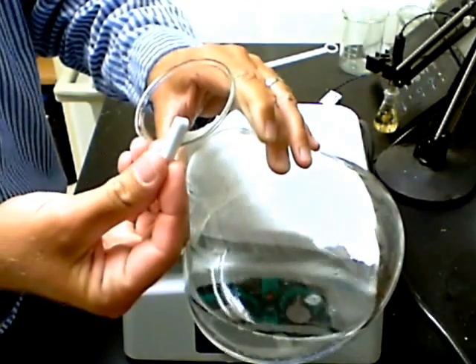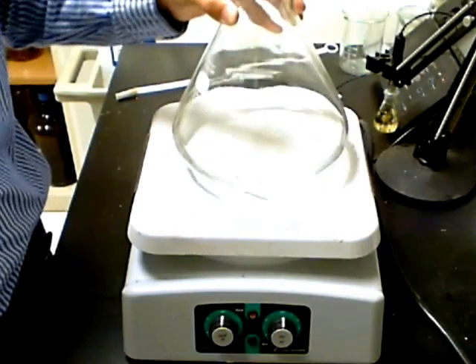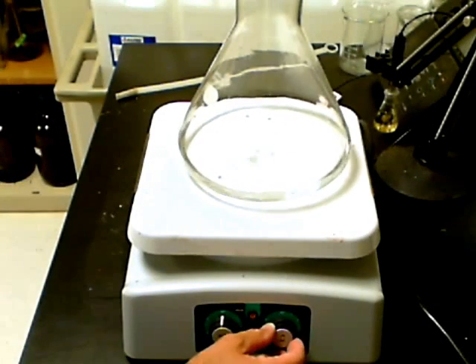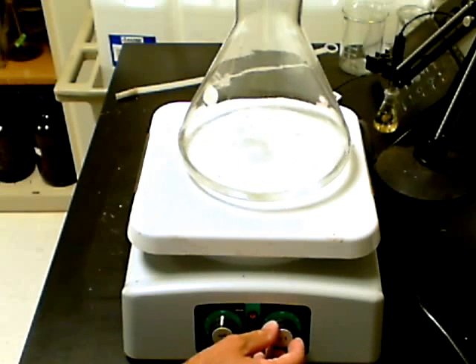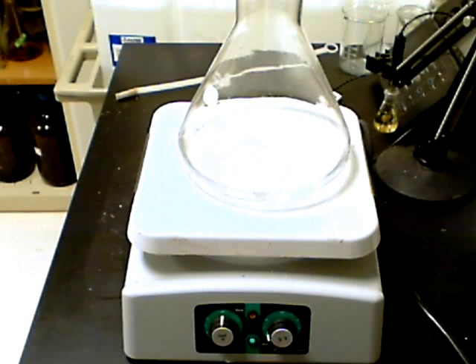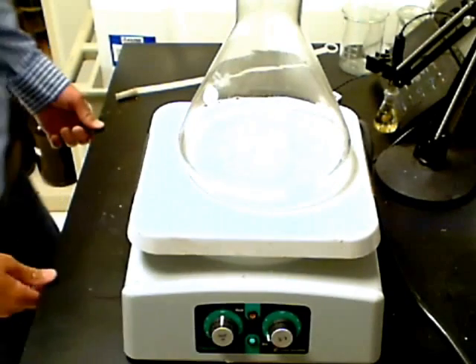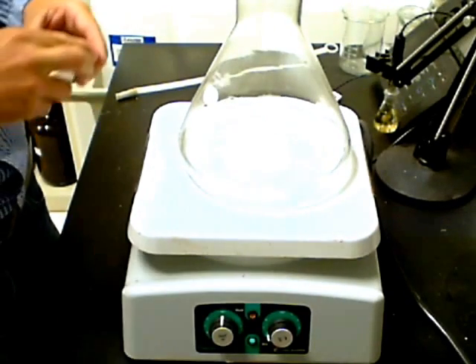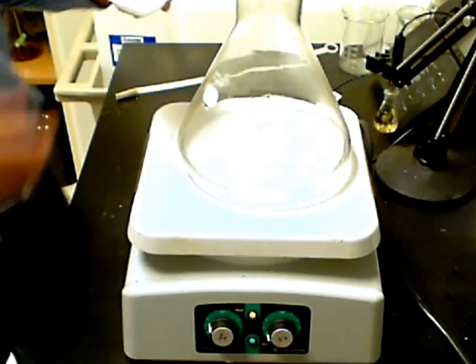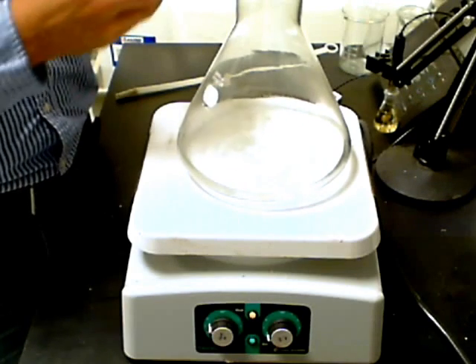Slide the magnetic stirring bar into the flask down the side, and set the flask onto the stirring hot plate. Begin stirring the water by adjusting the stirring knob. At this time, we will also want to turn on the heat. Agar powder must be boiled for about one minute to help it go into solution. Stirring is needed so that the agar does not stick to the bottom of the flask and burn.